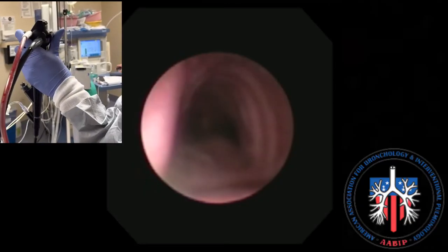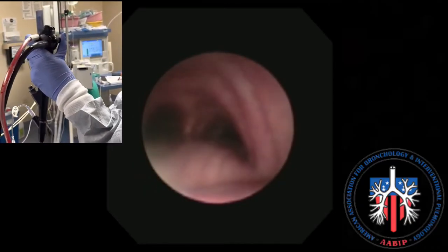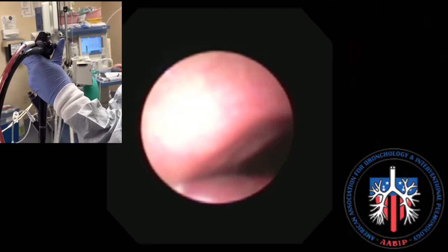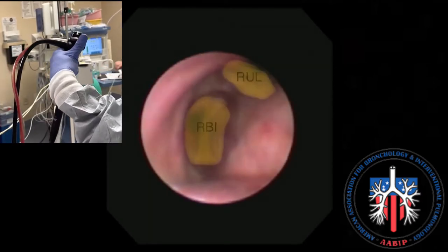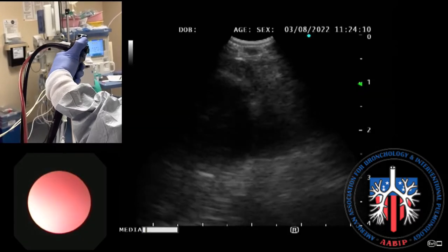Station 4R is identified by advancing the EBUS scope into the distal trachea towards the right main stem bronchus, identifying the right upper lobe and right bronchus intermedius. The scope is then flexed to identify the azygous vein.